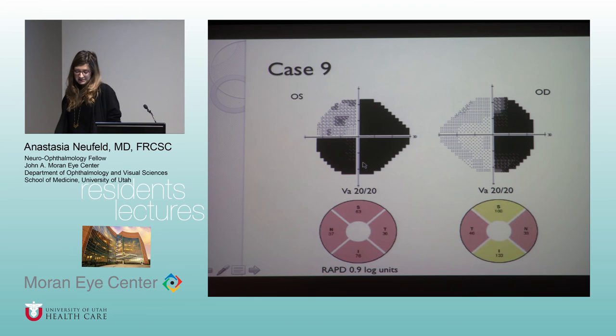Correct. So you have options here. You have a homonymous visual field deficit, this is complete, so you think it's retrochiasmal somewhere. You think maybe that could be bitemporal, so that locates you to the chiasm, right? Or you can have this altitudinal visual field deficit, which points you to the nerve, right? And I gave you some clues here: a relative afferent pupillary defect on the left, and this pattern of the OCT. Very good. So you are really worried about this. Are you thinking more occipital lobe here? Are you thinking more anterior here? More anterior, exactly.